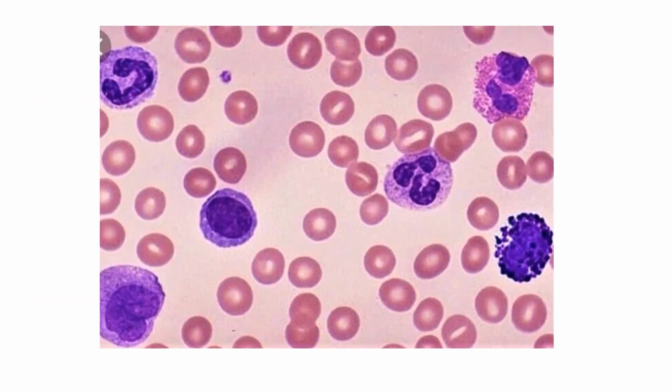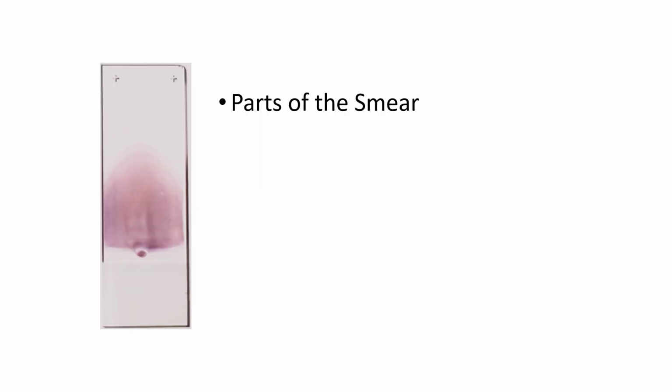And once again here, so what are these cells which don't have any nuclei? These are the RBC, and now we have the WBC here. I'll talk about the different types of WBC just in a while, and we also have this thing which is the platelet.